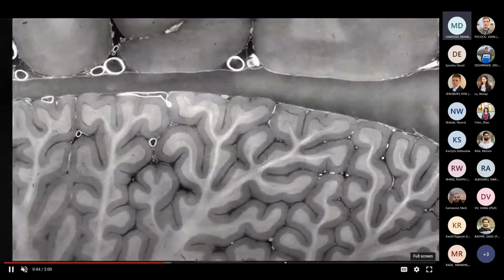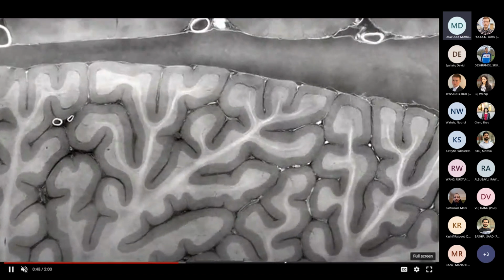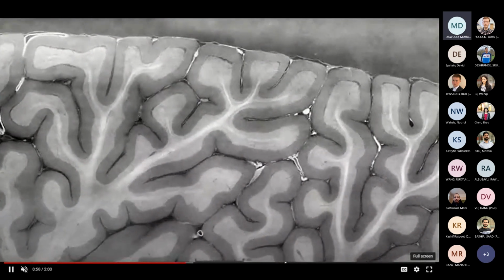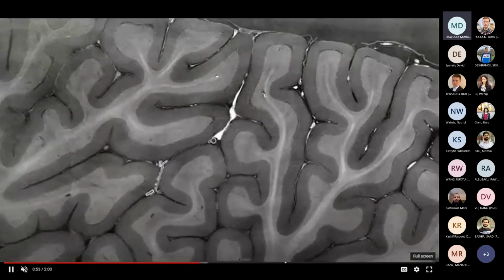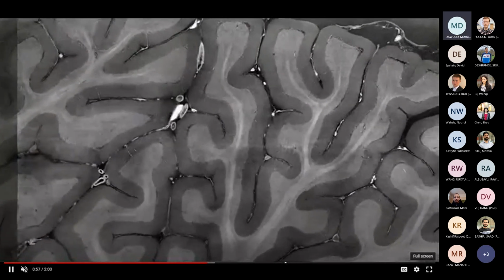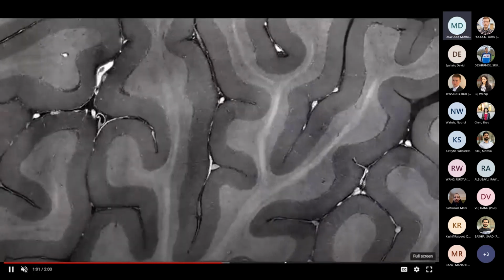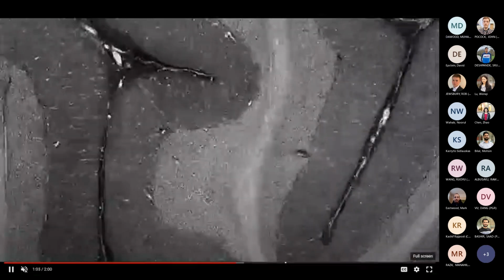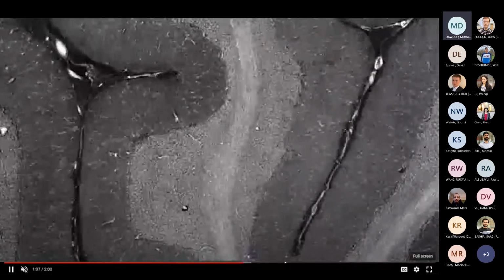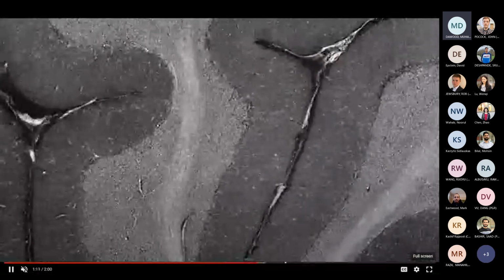In comparison, this took about 30 hours to scan, but again, this was ex vivo. One of our collaborators is actually involved in this study, so that's how we got into it. That's much better, because it's going through multiple slices, and it's going deeper.